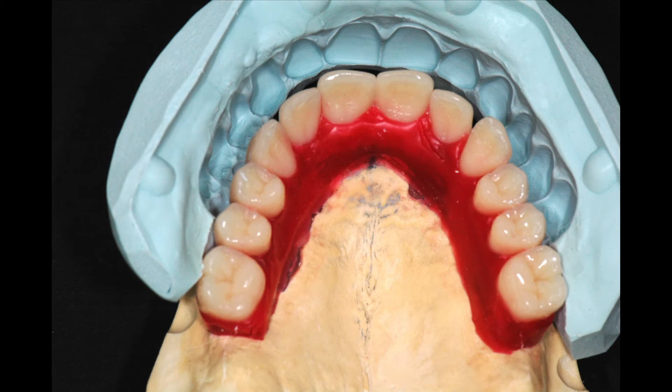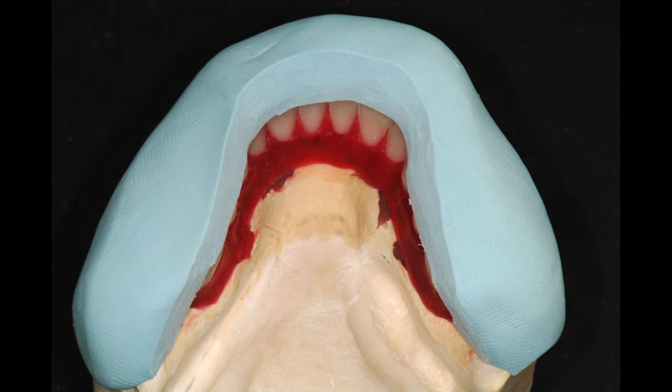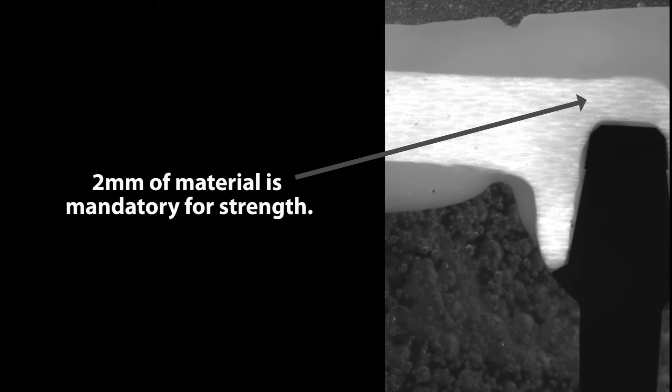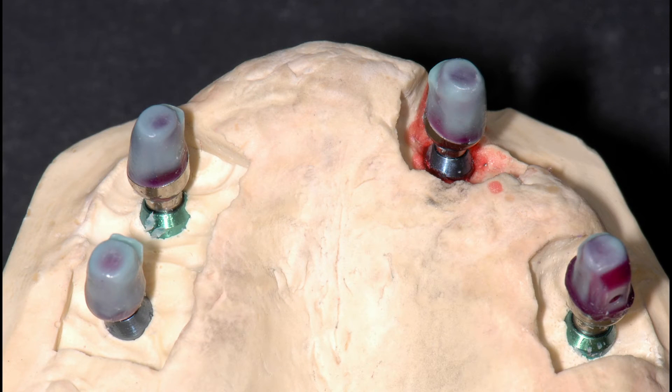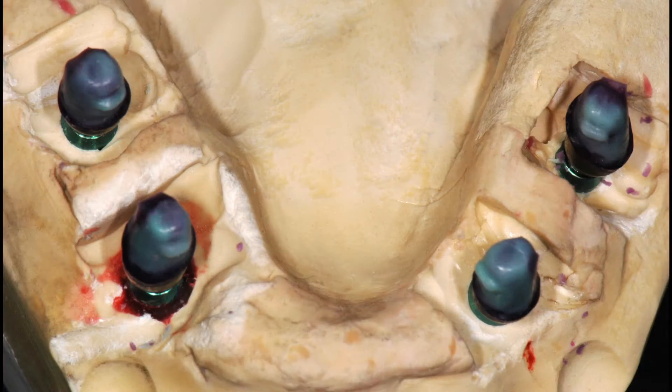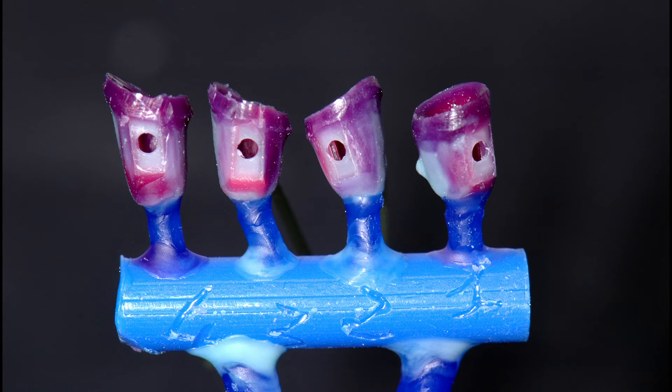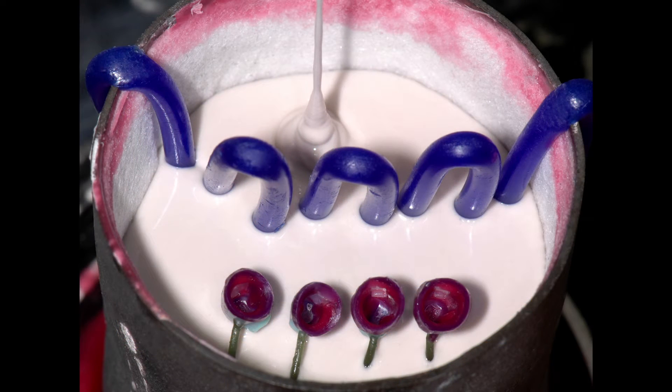Labial silicone masks of the wax teeth arrangements were fabricated to evaluate the selection and modification of the universal abutments, ensuring sufficient space for the mandatory two millimeters of TRINIA material over each abutment. Once the abutments were appropriately modified to provide adequate spacing, eight telescopic retentive copings were waxed onto the milled abutments, to which retentive Si-tec TK-Fric attachments were then soldered.